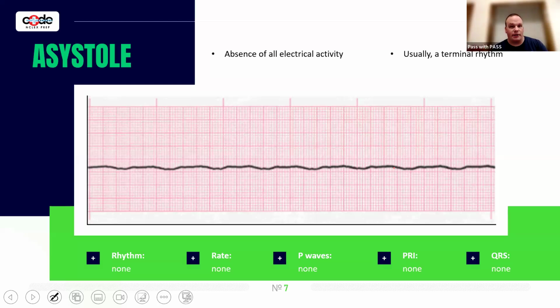That's why, from an EMS side, if we're going to pronounce a patient in the field, meaning we're going to announce that the patient is dead, we try to document that we saw asystole in 2 or more leads. That's just extra verification that what I was seeing on the monitor in the very beginning in lead 2 was legit. It was asystole. I also verified that in lead 3 or lead 1 or whatever lead it may have been.